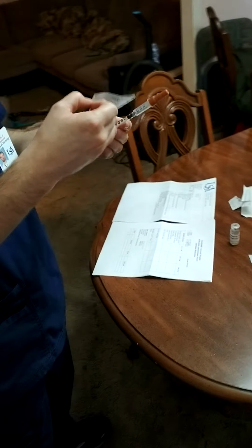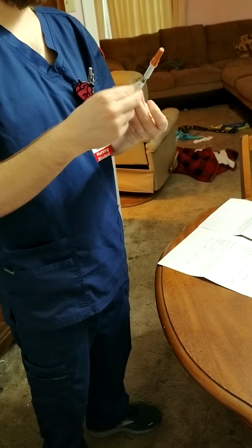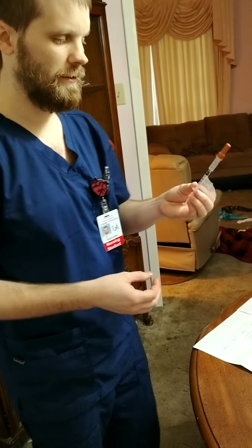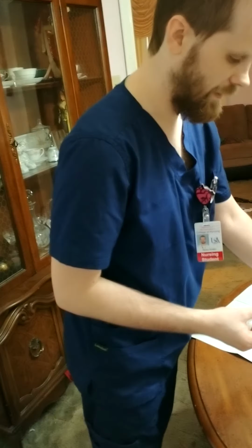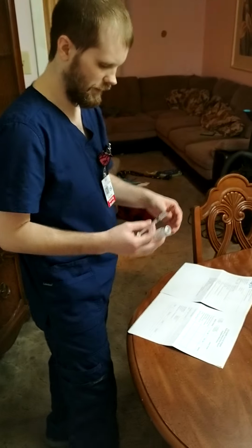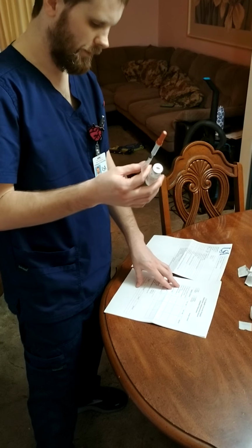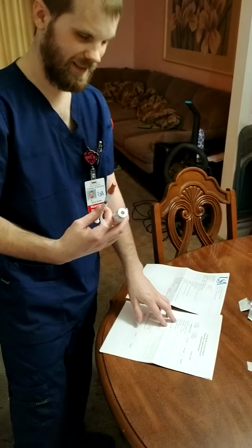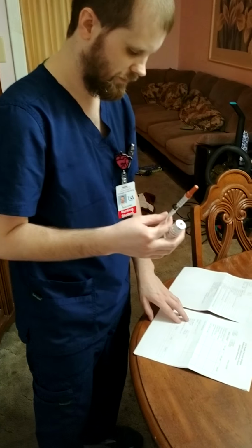And I'll place my label on my syringe in an area out of the way of my numbers so that I can still see that I have my appropriate amount. And I will do another check. So I have heparin, so that is the right medication. The right patient is Jaguar Jones.